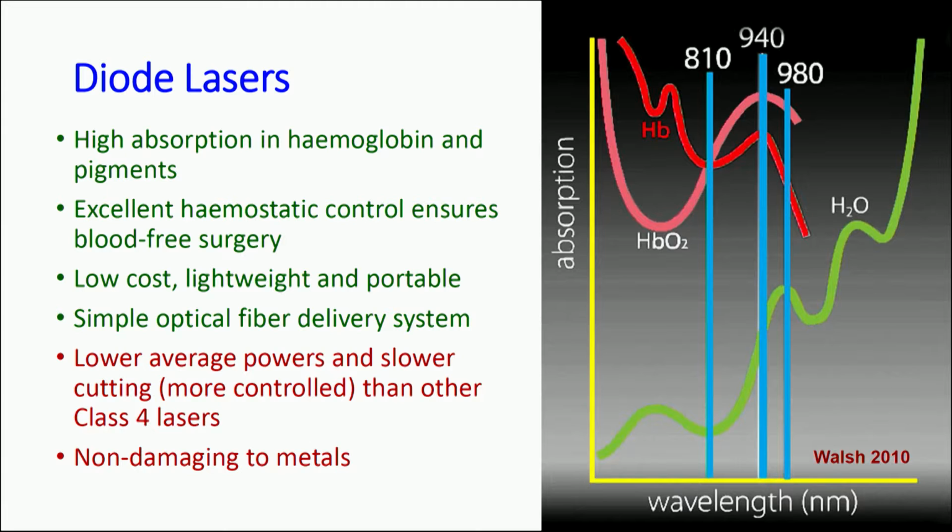But really cleverly, the same seared surface is what cells migrate over. So it acts like a type of scaffold for a wound dressing, which is a really useful point. Within the family of diode lasers, there's actually quite a few different members. So I thought it might be good to talk a little bit about the members in the family. Different numbers, because the Gemini laser's special in that it has 2 laser wavelengths for treatment and another laser wavelength for determining where the beam is actually pointed. And I'll demonstrate that when I do a little hands-on session a little bit later on.